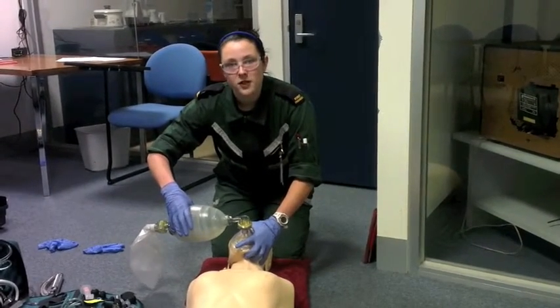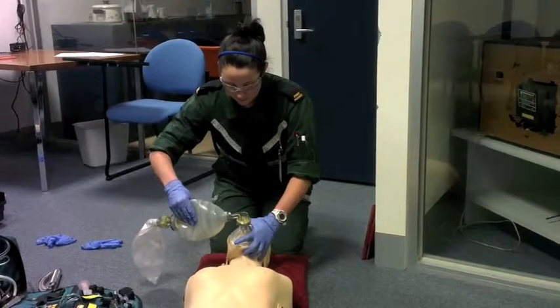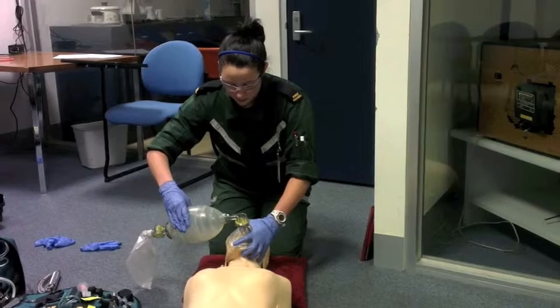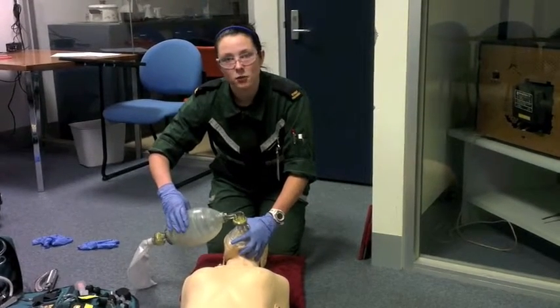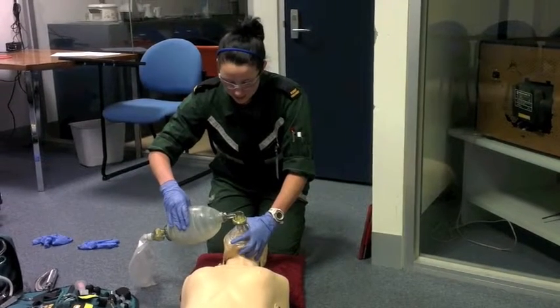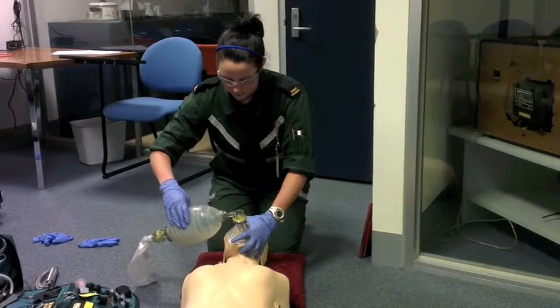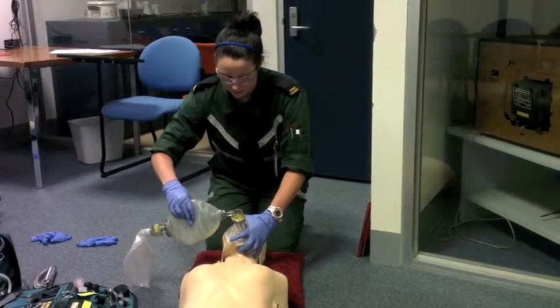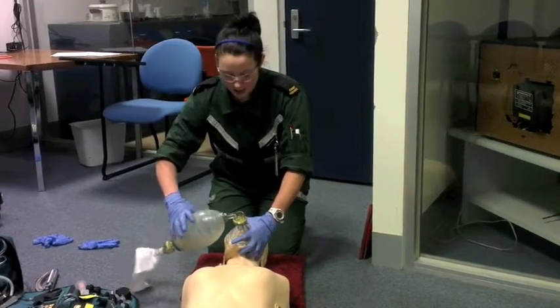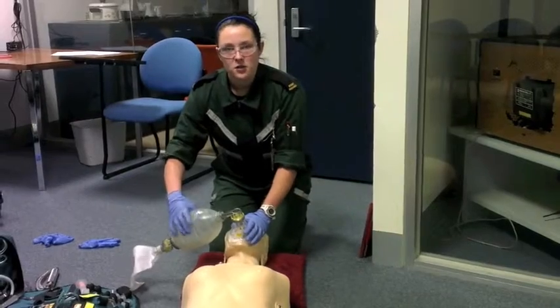I will provide 1 ventilation every 5 seconds. While I'm doing this, I'm checking the chest for adequate rise and fall to assess whether the seal is adequate. A common error of this is not maintaining an adequate seal, as this will result in inadequate oxygenation of the lungs.